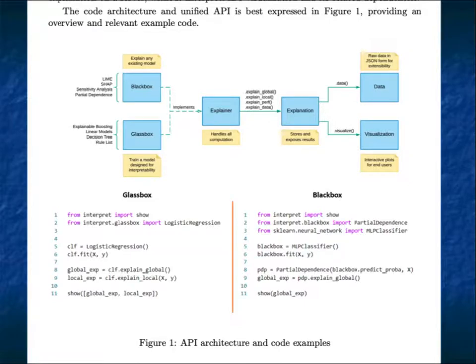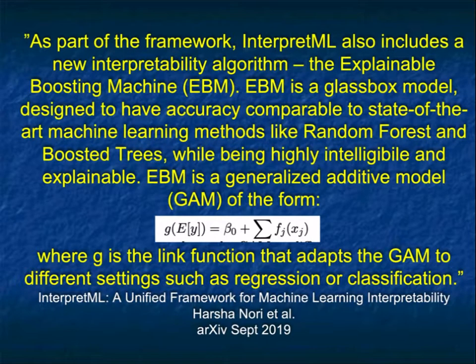And here's just the architecture, but what makes it very exciting even conceptually is everyone is afraid of the black box. The glass box is what we want to see. We want to know how decisions are made and how we can improve decisions. If you have a black box, it's hard to figure out how to improve things. With a transparent or glass box system, you could improve things.